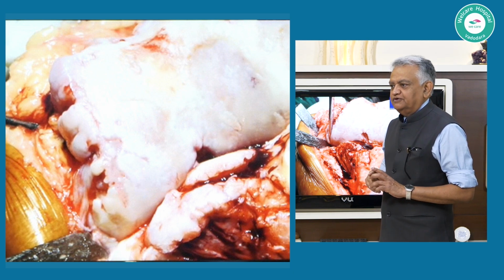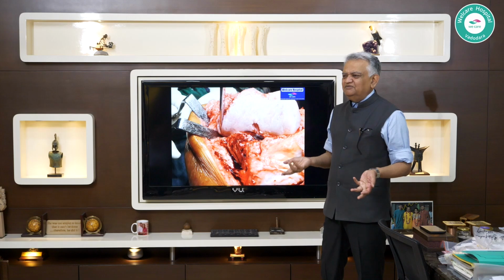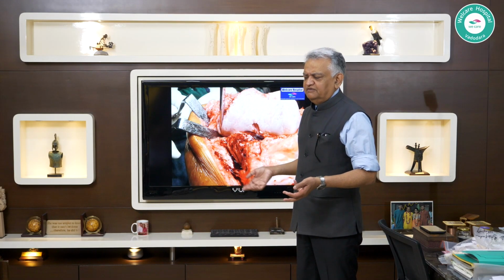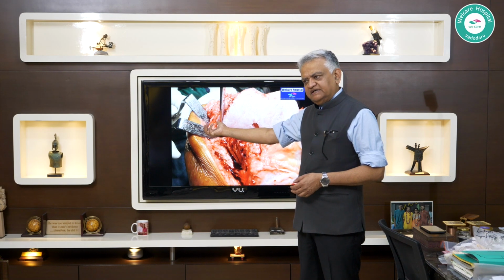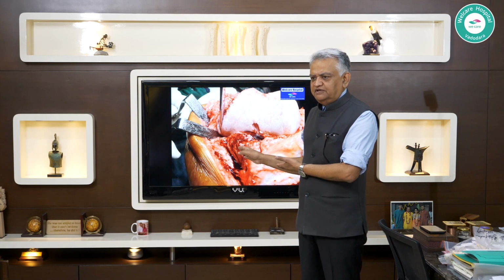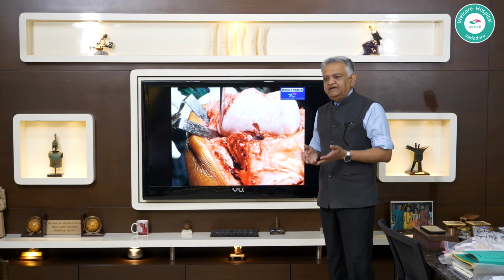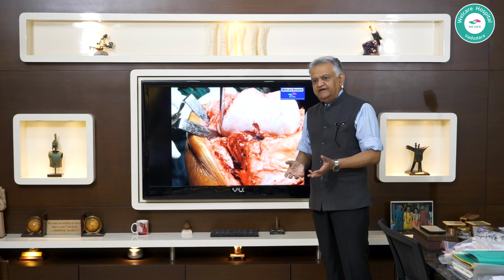In the early phases of your career, and I do it even now, because with my dexterity, if I can call it that, it takes me 35-45 seconds, 1 minute to remove all these osteophytes. Why not do it? Now the entire team is aware, the nursing staff know the moment they see a deformity. So when I do this, they give me exactly the curved osteotome that I want to knock off this osteophyte, a straight osteotome for that osteophyte. They know as much as I do. So it takes me 45 seconds, 1 minute to remove the osteophytes, and now my brain is actually assessing everything based on the original volume of that bone rather than the fake volume.